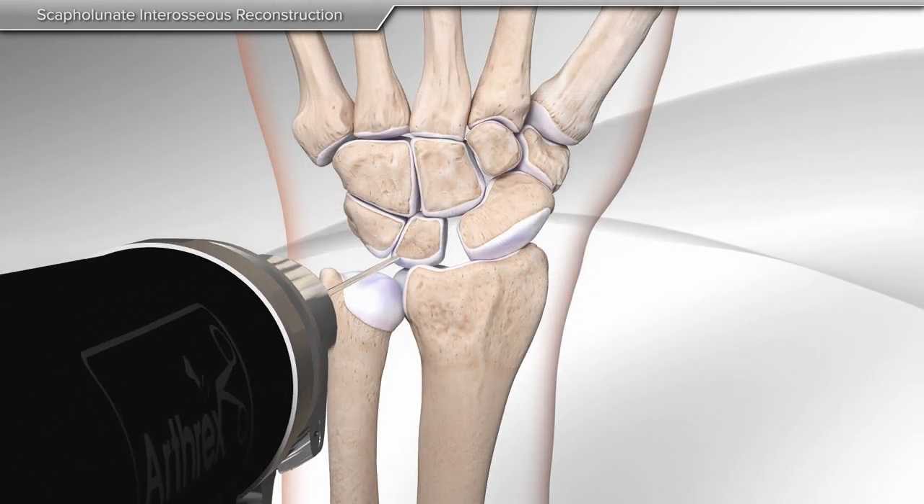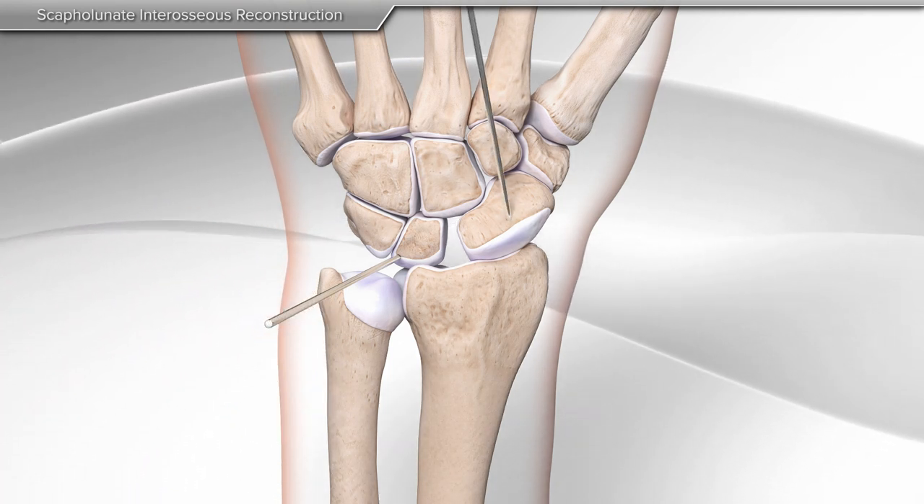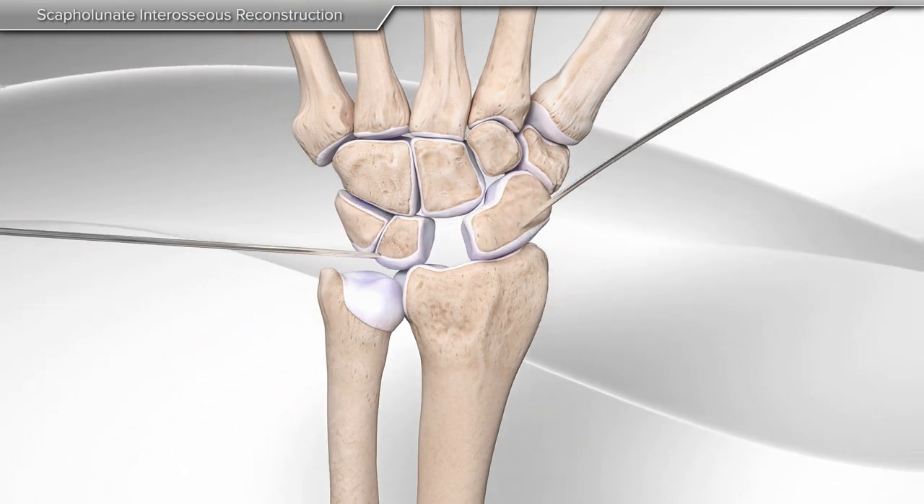Then, a metal wire is placed on each bone to help reduce the deformity. Additional metal wires are placed onto the scaphoid and lunate as guides.